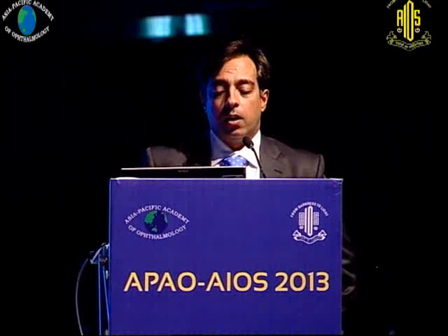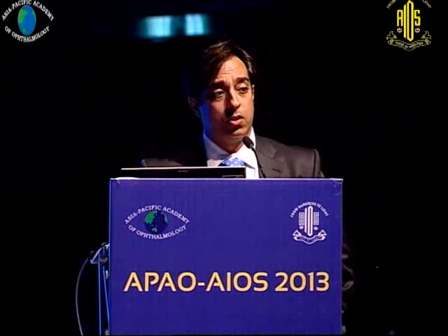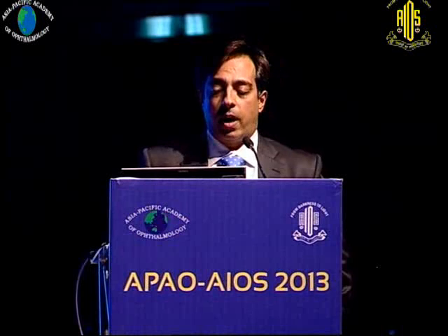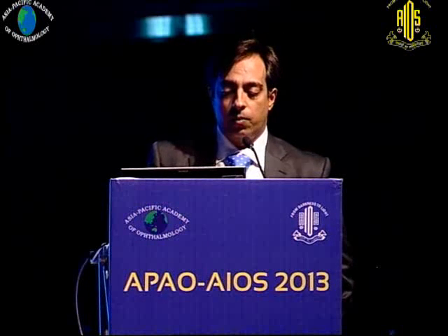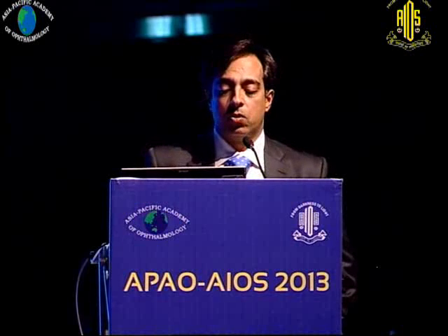Similarly, if there is a thick epiretinal membrane and your first aim during the surgery is to go in and remove the hyaloid, so we stain it and in the same way approach it by high suction over the triamcinolone stained area. But here, as you can see, as we are pulling the vitreous, the membrane, which is well formed, also tends to show a movement.